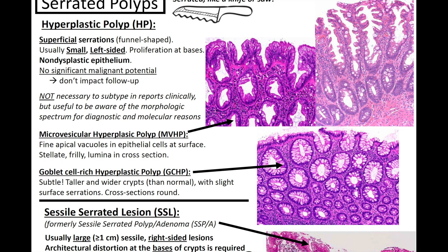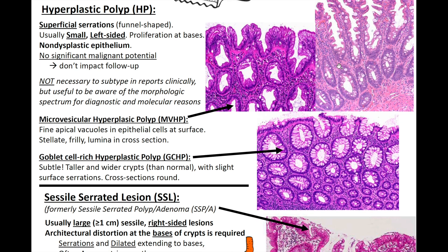Goblet cell-rich hyperplastic polyps are extremely subtle. After staff pointed it out and comparing it next to normal colon, you'll see the goblet cell-rich area is lighter and cleared out — that contrast helps it stand out. For hyperplastic polyps, the serration is up top near the surface. It's not going to be dilated or as serrated at the base, like we'll see in our next entity: SSLs.